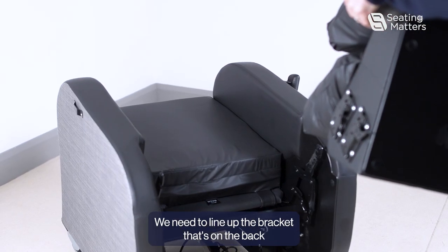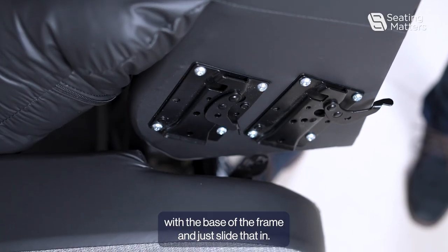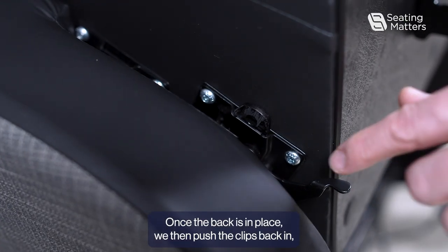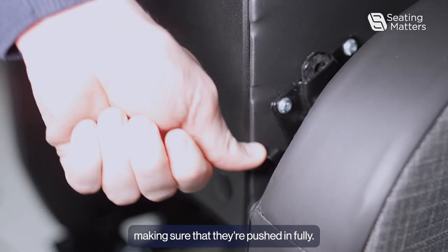To put the back on, we need to line up the bracket that's on the back with the base of the frame and just slide that in. Once the back is in place, we then push the clips back in, making sure that they're pushed in fully.